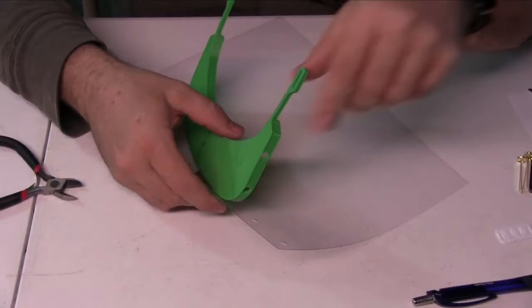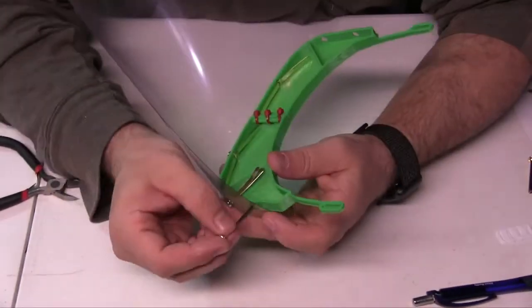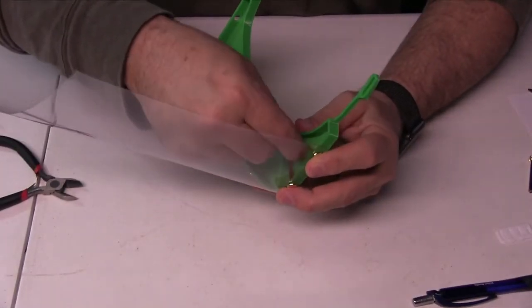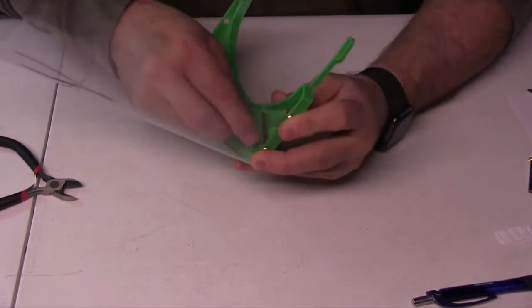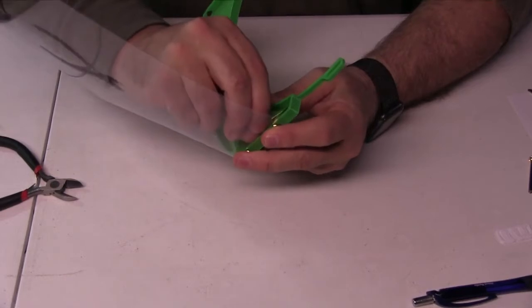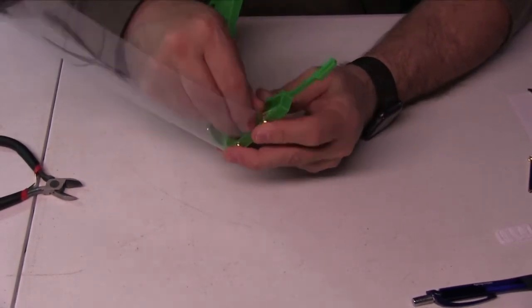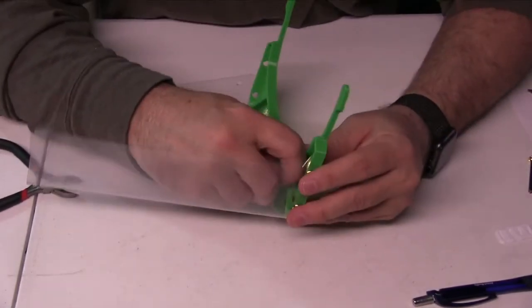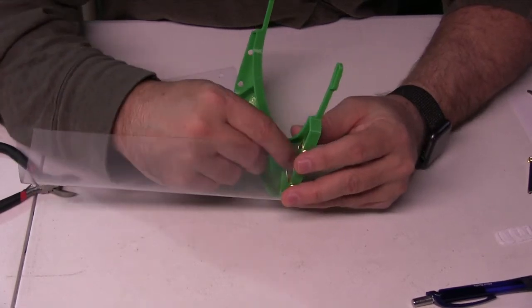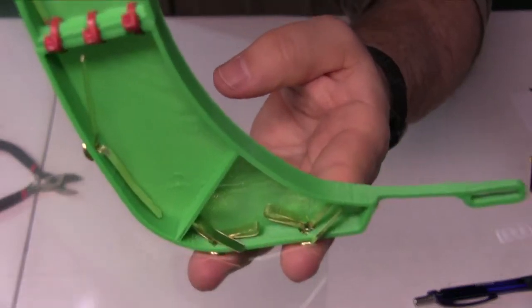See, I'm not holding on to it. It's attached with that one metal brad. So I'll go through attaching the rest of them. You'll see that, again, having the smaller brads is going to be a really important part in this. And I'm going to force these around and bend them smaller. I'll take this piece. Maybe I'll fast forward this part of the video. A little bit time consuming here, but with the longer brads, I've actually kind of twisted them around a little bit. Let me see if I can get this done here, and then I'll show you what I'm doing. You see here what I've done is I've sort of squinched them in there a little bit.